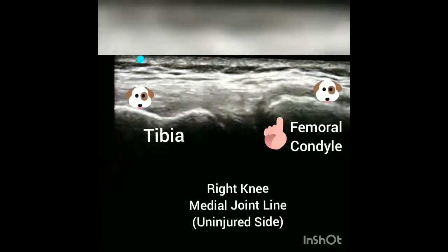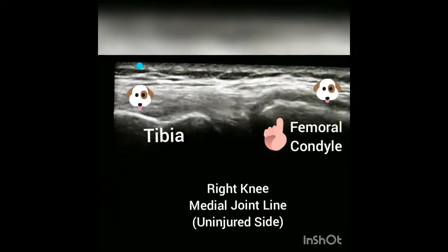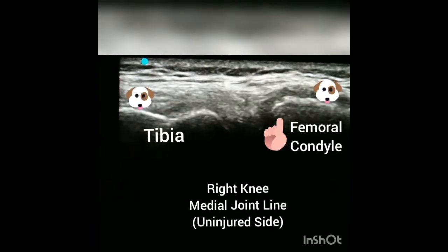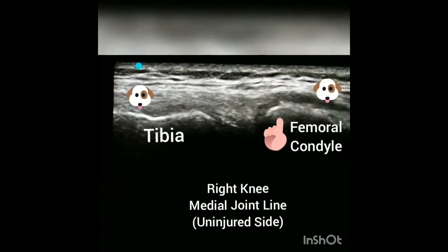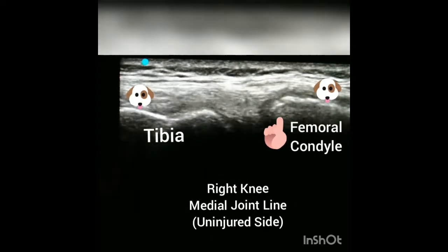On the normal knee, which is the right side, you can see the medial collateral ligament, which is represented by the two dog heads. Directly in the center is the medial joint line. Now as I'm placing valgus stress, you can actually see a little wiggle around the medial femoral condyle where the finger is pointing.